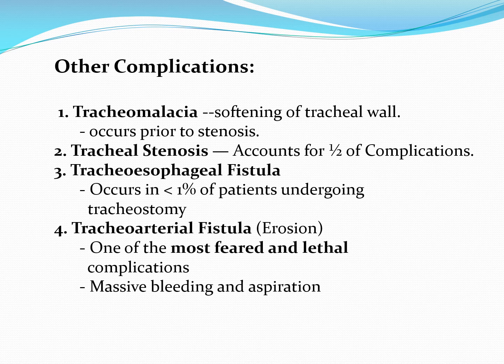Just a bad place to be. The only real hope for a patient like that is if you can get the cuff of the tube to where the erosion is and hold it there. You're not going to be able to see. The bleeding will slow down immensely if you can do that, and then get the patient to the OR without moving that tube at all. But in all likelihood, the patient will pass away because of that.